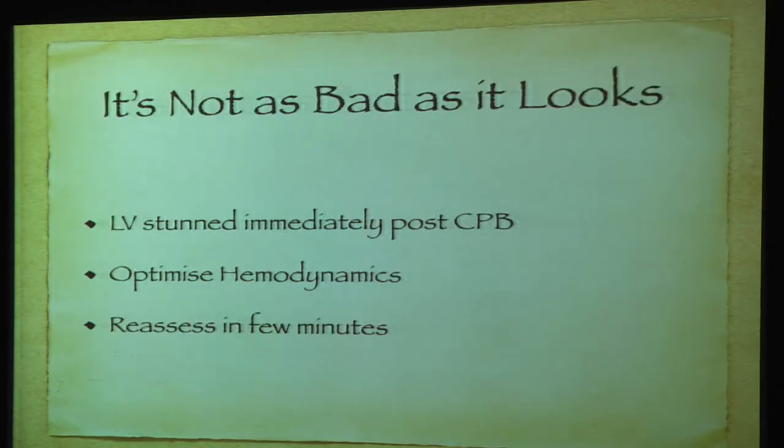Remember, sometimes it's not as bad as it looks, okay? You just came off bypass. The LV is a little stunned post-bypass with the PG and all. Your hemodynamics are not good because you're tachycardic, you're on some sort of pressors, you're on inotropes and chronotropes. You're hyperdynamic, you're hypovolemic, low SVR. All those things affect your evaluation of the mitral valve, okay?